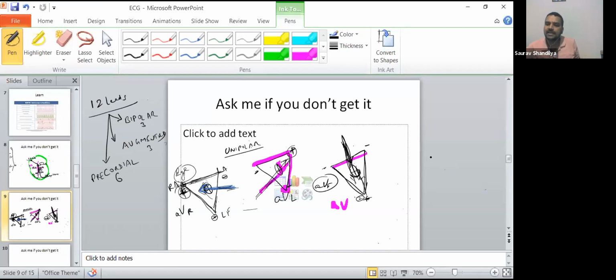I mean to say, earlier you had just two views. Now, for example, this is your heart, so you have other views also. Earlier you had this, and now you'll be able to have this and this. The more views you create, the better it is for you.